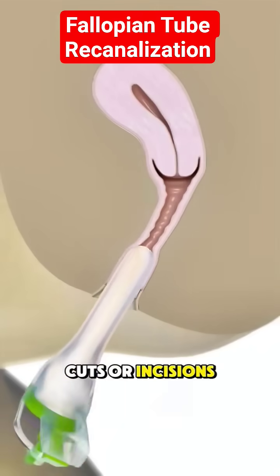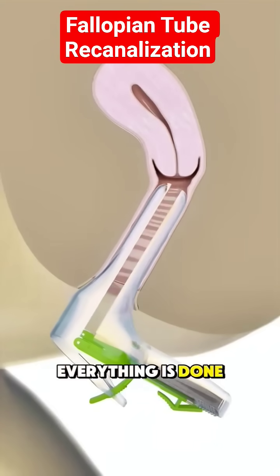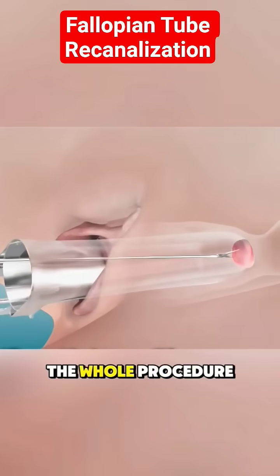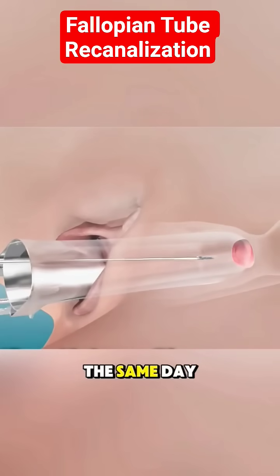There are no cuts or incisions. Everything is done from inside through the natural openings of the body. The whole procedure is usually quick, and patients can often go home the same day.